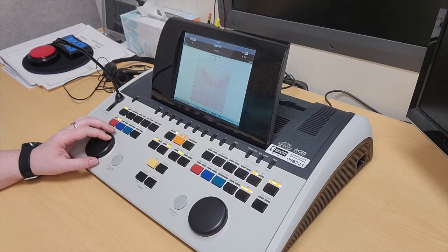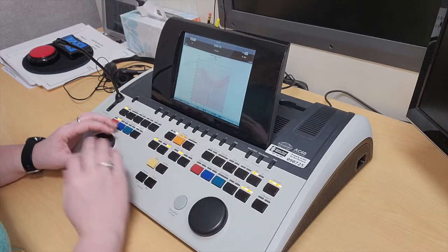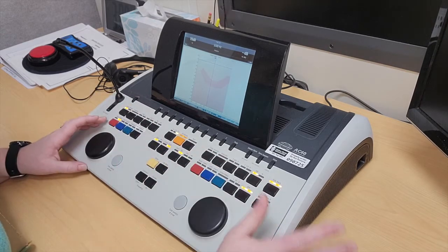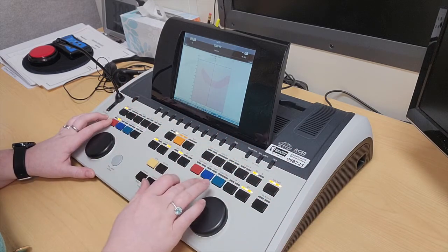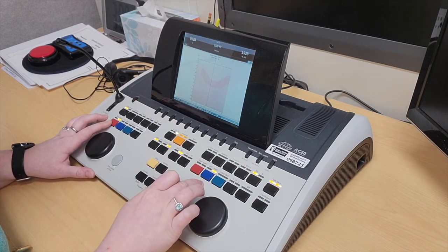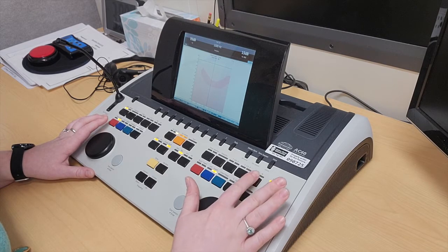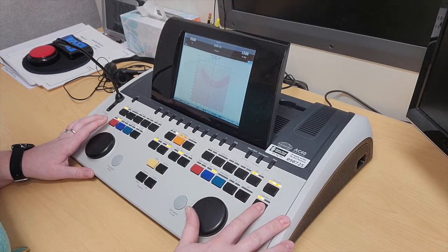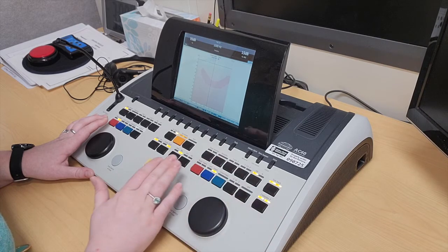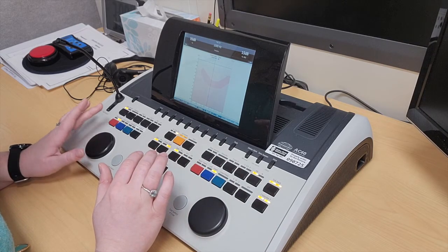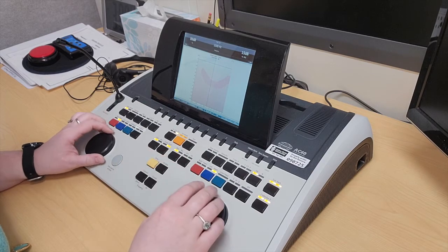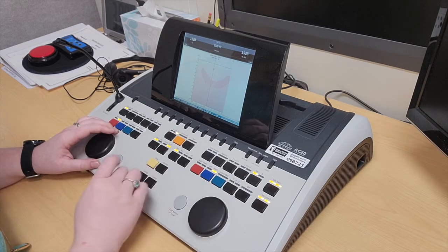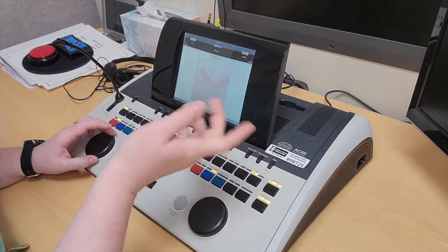For masking and presentation, I would use both sections here. Right now it's on insert and we're on left insert as well. If I wanted them to go together, I would press sync and then they're going together.